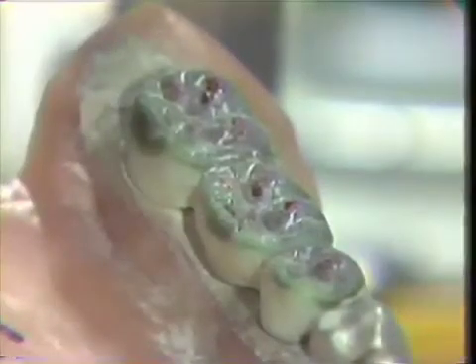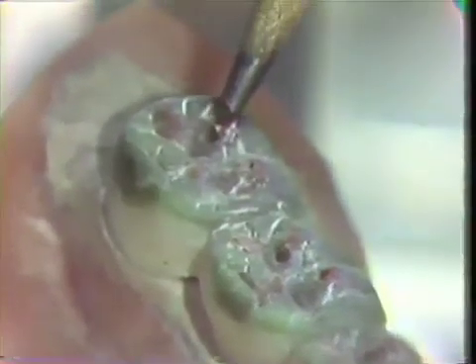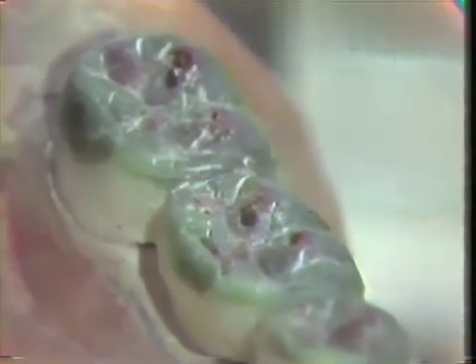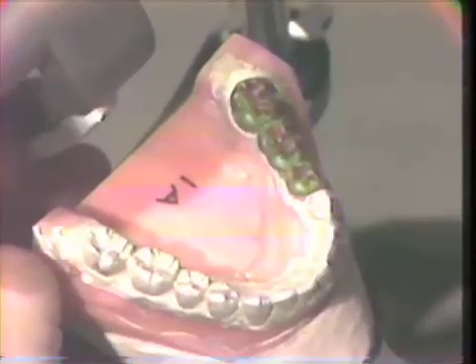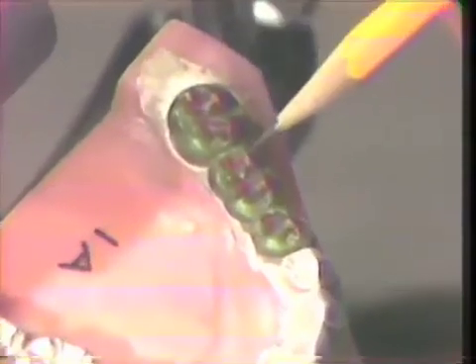Close examination of the wax-up does reveal that on the mandibular pontic and on the mandibular second molar wax-up, a balancing interference is present. These are on the lingual inclines of the buccal cusps. After removal of these interferences, our wax-up will be ready for spruing and casting. We've now removed those interferences on the lingual inclines of the buccal cusps of the molar and the pontic wax-up.